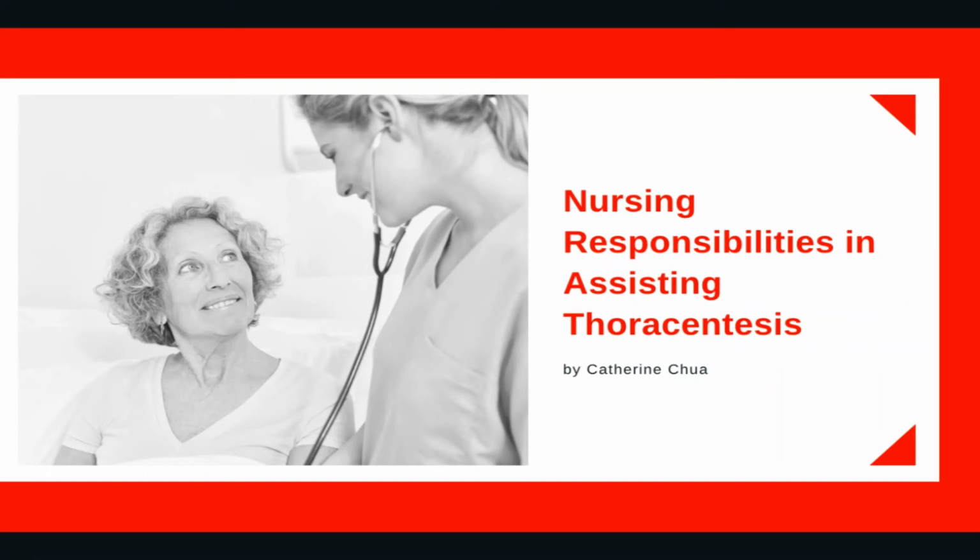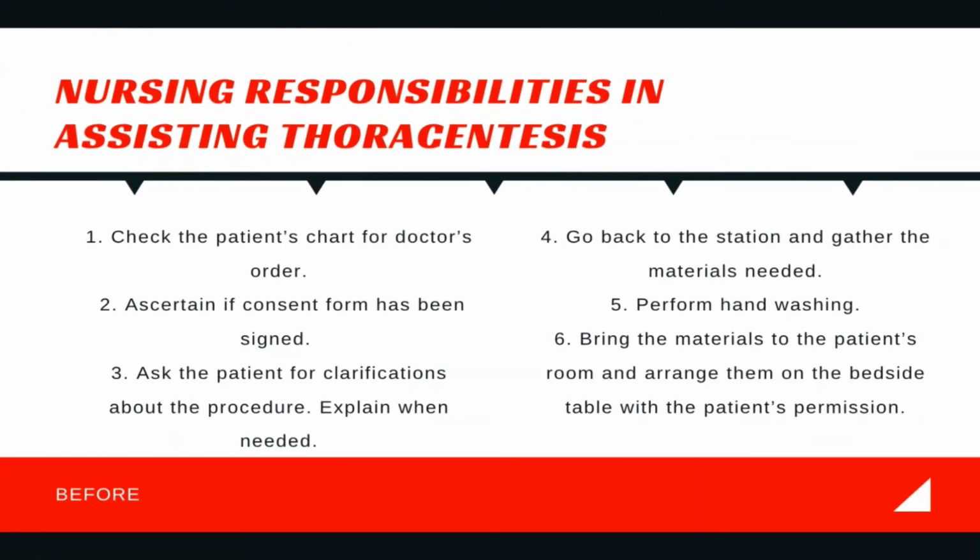For this part of the report, we will be presenting the before, during, and after nursing responsibilities in assisting thoracentesis. These are the pre-procedure nursing responsibilities.